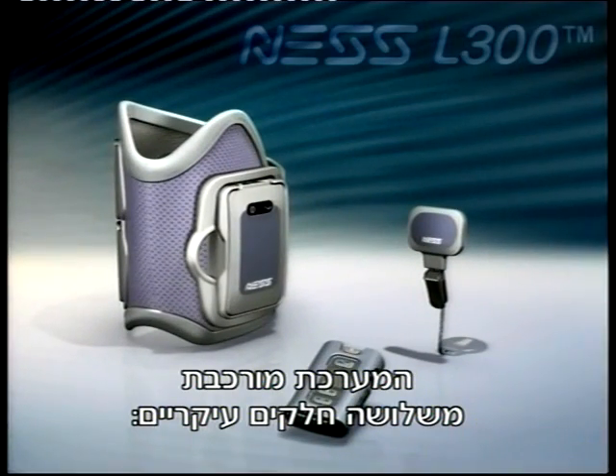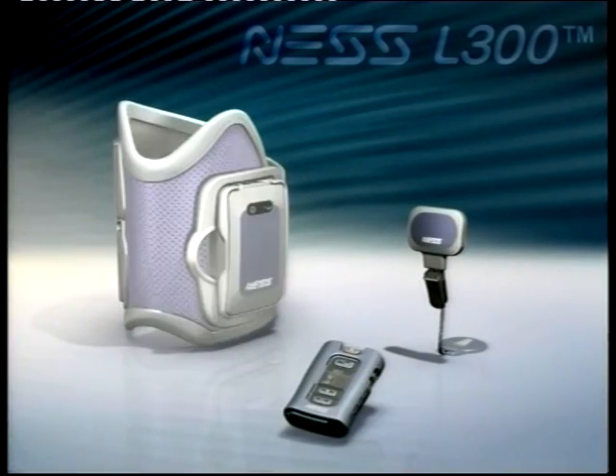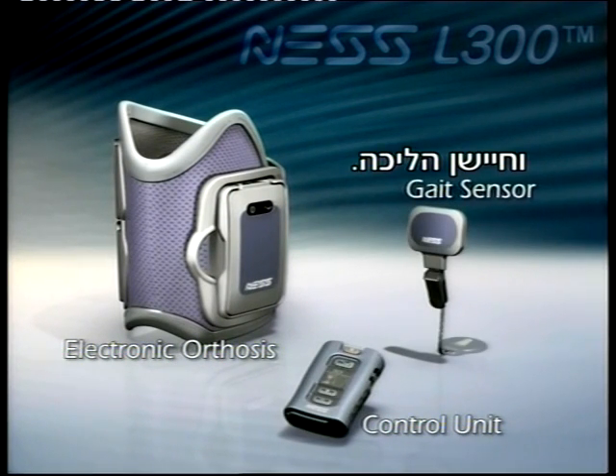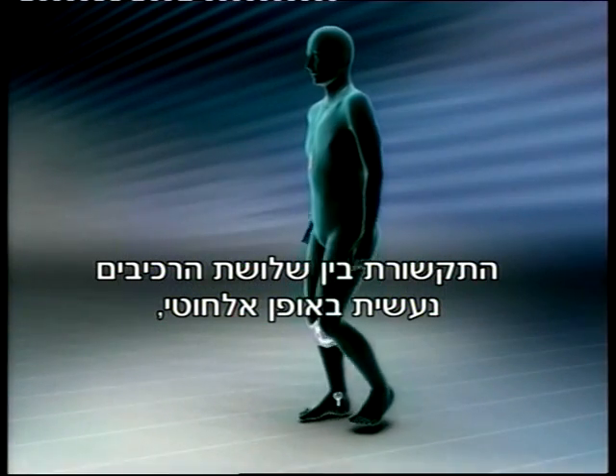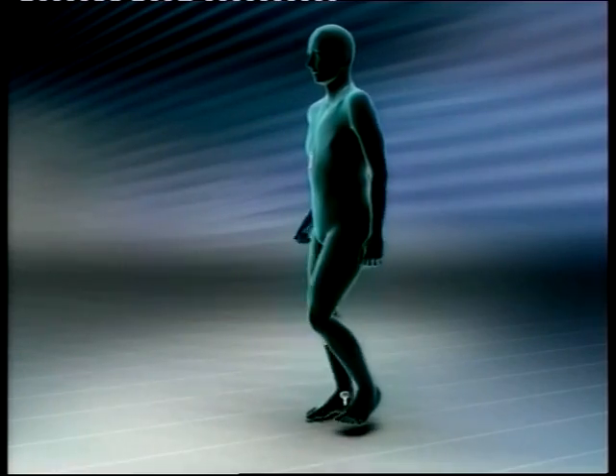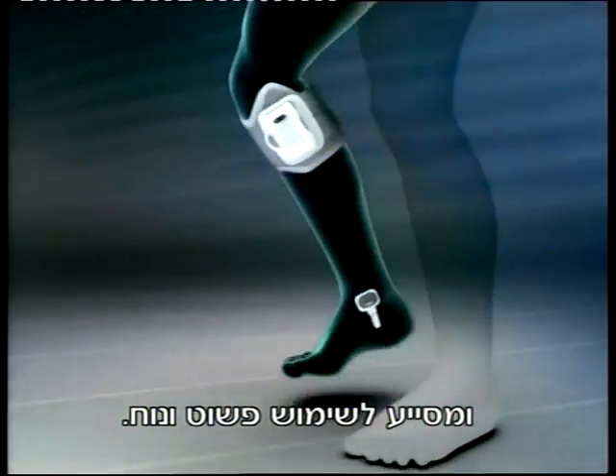The system consists of three main components: an electronic orthosis, a control unit, and a gait sensor — all of which communicate wirelessly, eliminating the need for troublesome externally worn wires and connectors, making the system simple and easy to use.